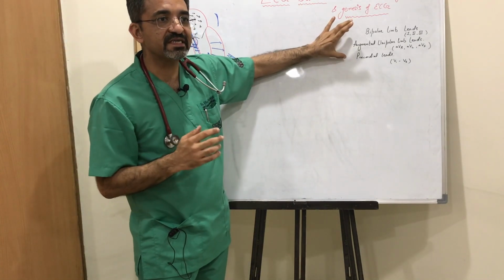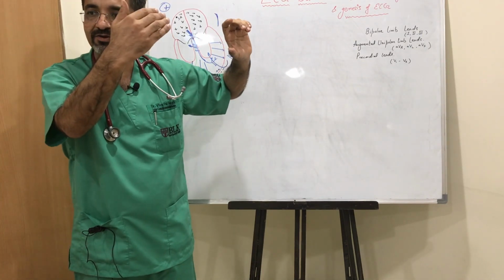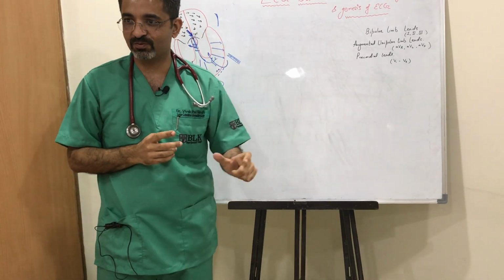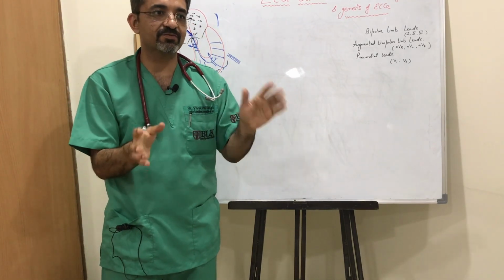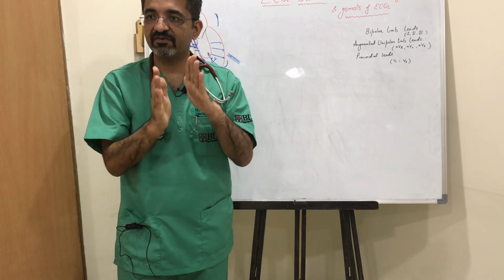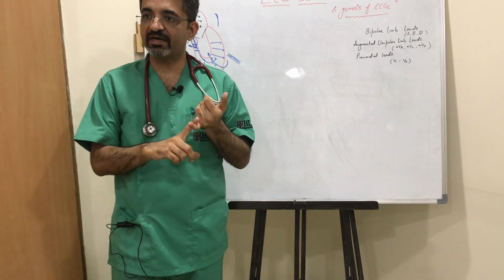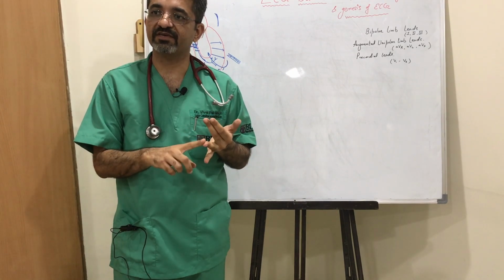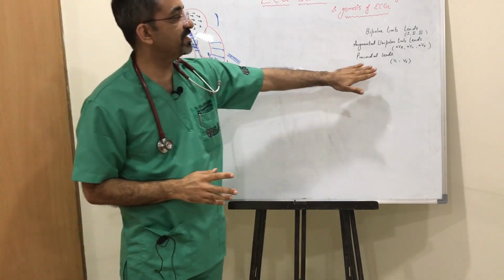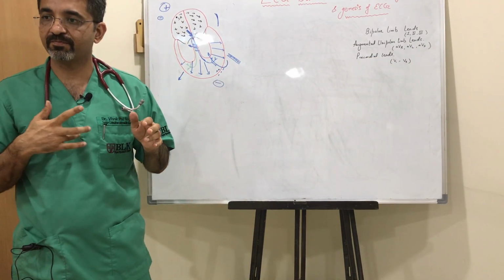Whenever you encounter an ECG where the morphology of lead 3, lead 1, lead AVL or lead AVF is not similar to lead 2, or has dissimilar morphology, that means there is some problem. Lead AVR is the exact mirror image of lead 2. So 1, AVL, 2, 3, AVF will look exactly similar. When we talk of precordial leads V1 to V6, we should thoroughly remember their placement.